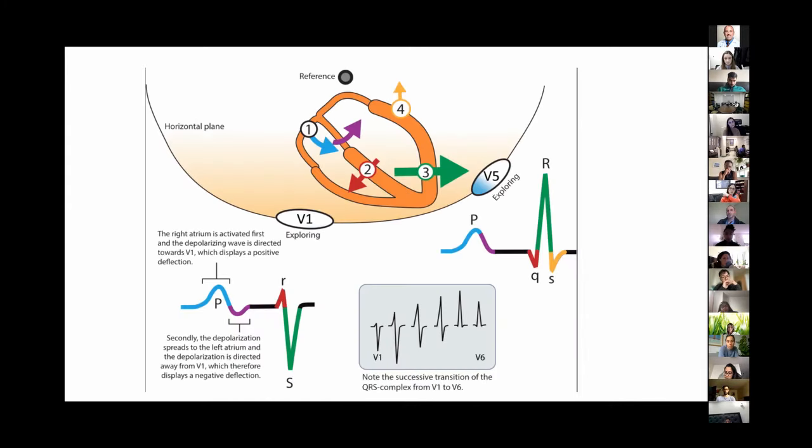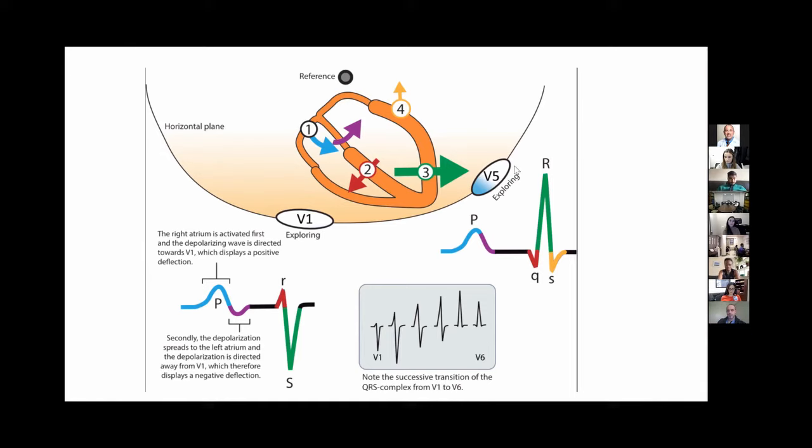So before we go to this, I need just someone to tell me, when you see a wide complex on an EKG, regardless of whether that's tachycardia or slow rhythm, what are the possibilities? And it's very limited possibilities. I just want to get a feel of your thinking about this. Whoever wants to say, it doesn't matter if you don't know anything, just at least one differential. Bundle branch block. Okay, and then anything else?